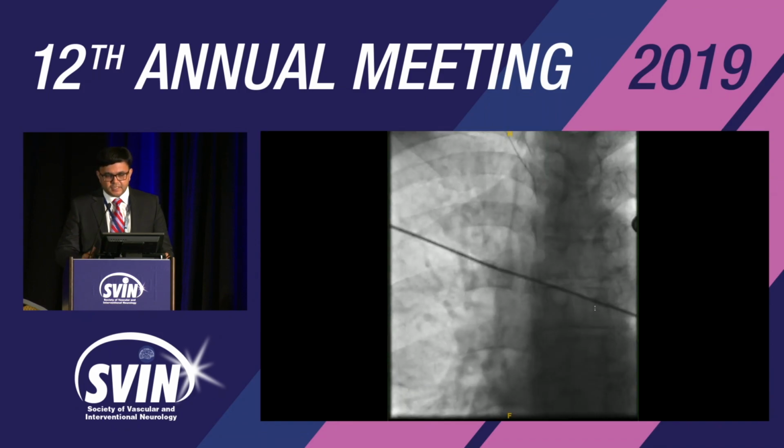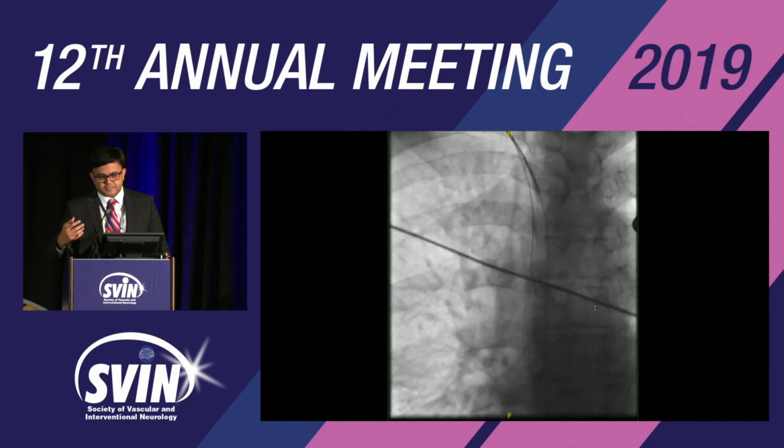If it doesn't form there, then you go over the valve. And I usually don't fight. If the catheter, the wire wants to go over the aortic valve, that's completely fine. The most important point is that you have to get a lot of purchase. Otherwise, the wire is going to go into the heart. So get as much purchase as you can, and then just track the SIM over it, and then it forms very nicely.